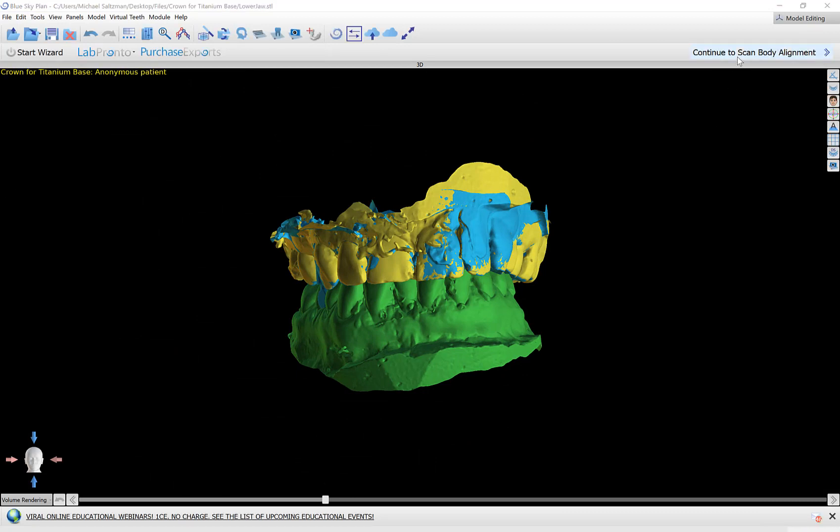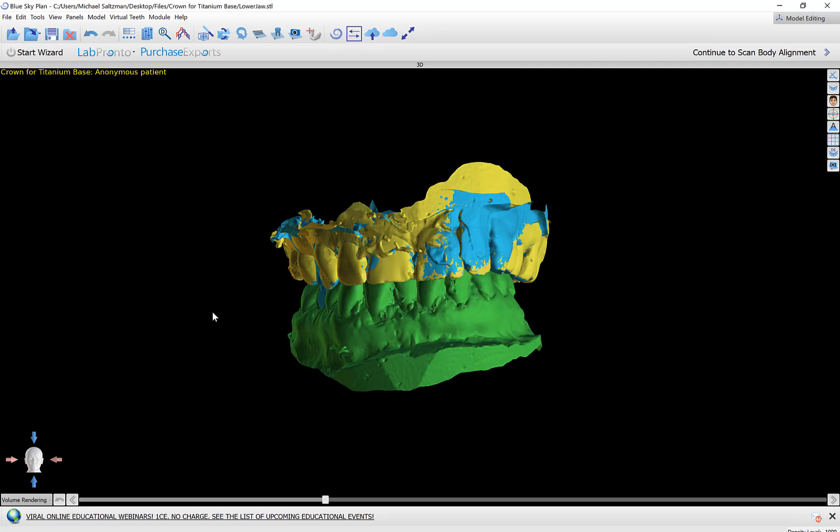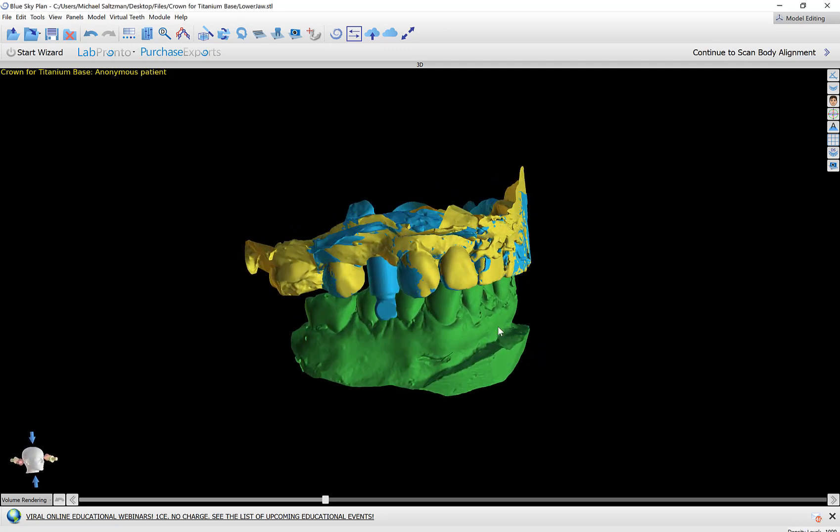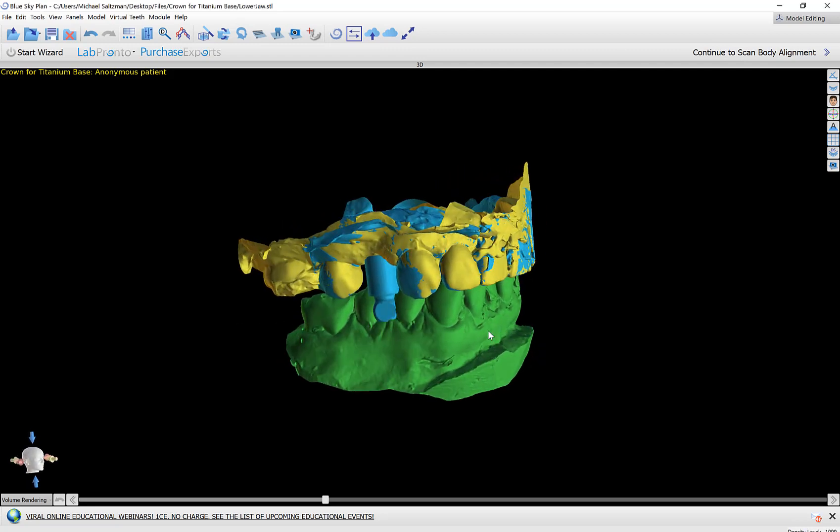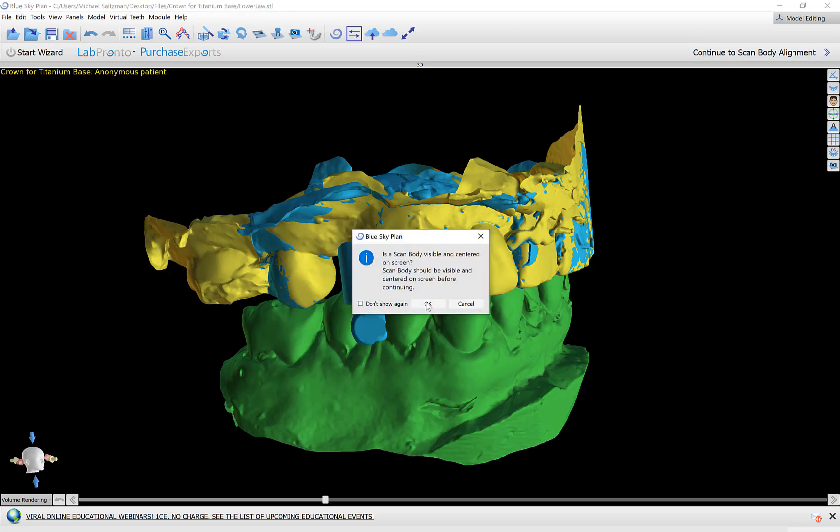The button in the top right continue the scan body alignment will take us there. This message is telling us that before proceeding we should make sure that the model is rotated and oriented so that we can see the scan body and specifically the flat part of the scan body. Now that that is done I could click continue the scan body, click OK.